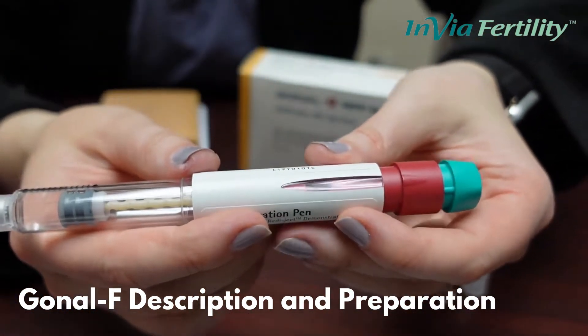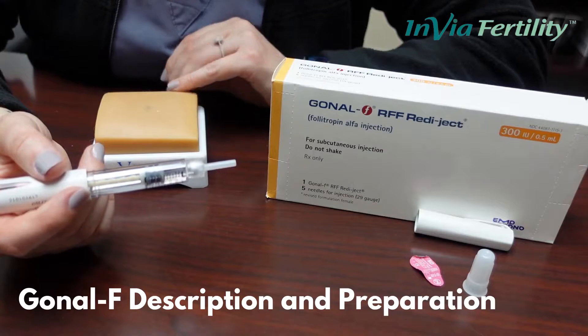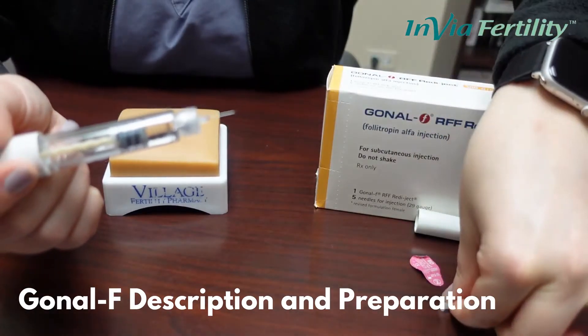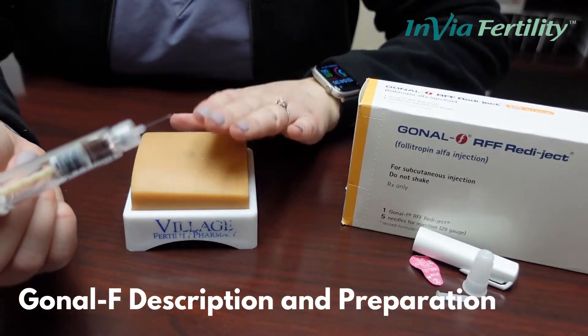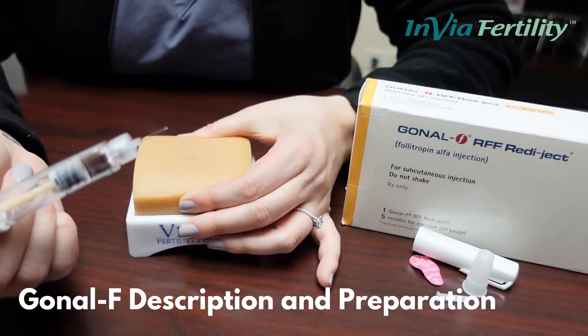Now we are ready for injection. Gonal F is administered subcutaneously in the belly or the thigh. Once you have your pen dialed to your instructed dose, you will take the small safety off. You will swab the skin with an alcohol prep pad and let it air dry for a few seconds.